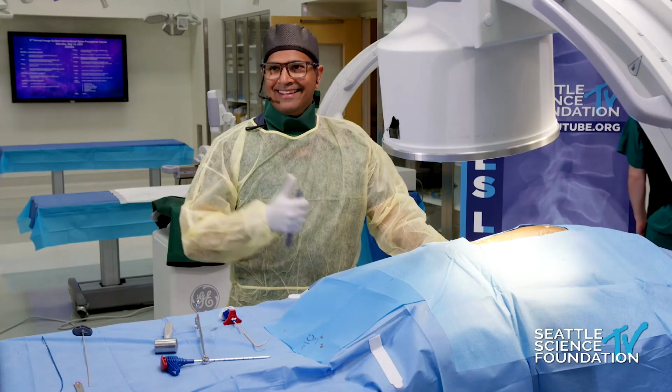Yeah, how are we differentiating between anterior column and posterior column pain before imaging? What gives you a hunch as to what the patient falls under? So in addition, apart from a diagnostic injection, the salient points for anterior column pain are midline pain, age of any variety, but discogenic pain is really 55 or less and vertebrogenic pain is 55 or more, presence of MRI findings, Modic type 1 or 2, and pain with what's called sustained hip flexion. And that amalgam is right at 94-95% positive predictive value for anterior column pain.